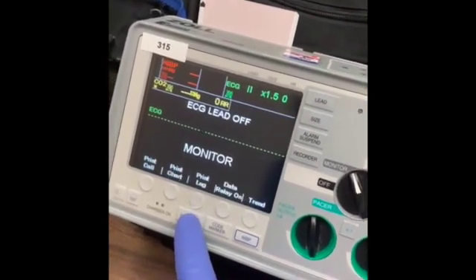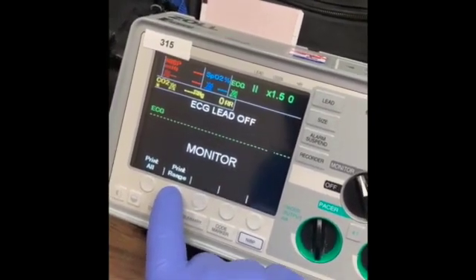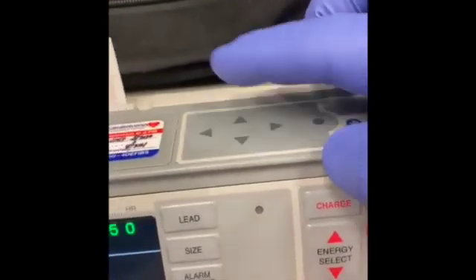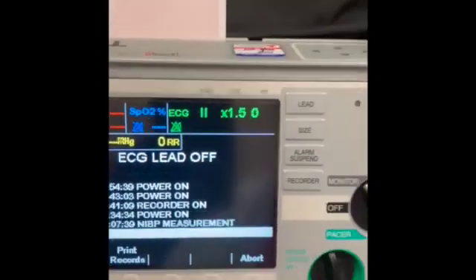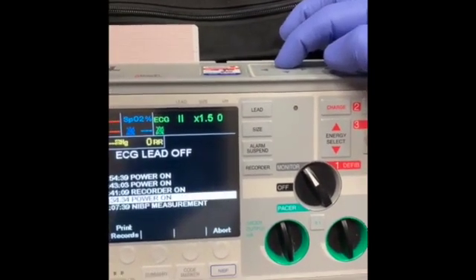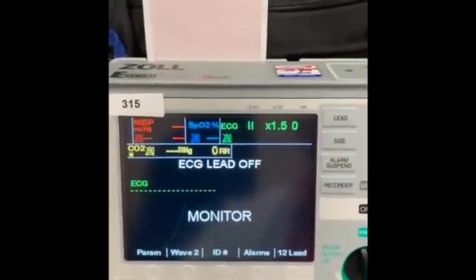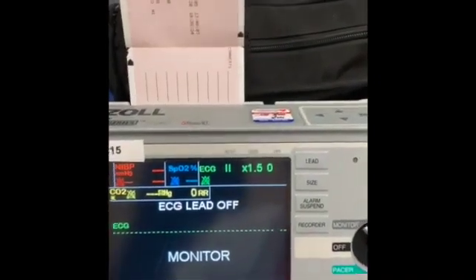When printing an ECG record, you select Summary. Go to Print Chart. Then go to Print Range. Once again, using the arrow keys at the top of the monitor, you will toggle and select which patient record you would like to print based off of the date and time. Once you have the proper record based off of date and time, select Print Record. This is similar to the code summary function on the PhysioControl LifePak monitor.